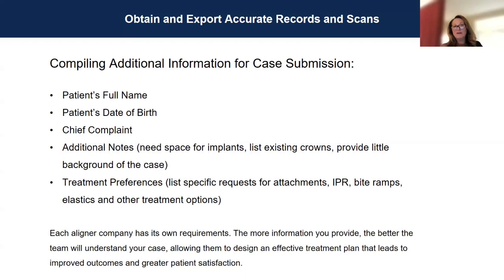She has an anterior tooth that is in crossbite, whatever it is, or even, like I said, a little bit of crowding now that they once had orthodontics, like they were in ortho for 2 years. That's good for the aligner company to know.